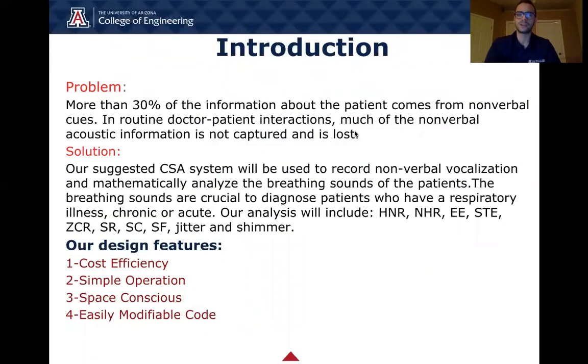When a doctor is diagnosing a patient, more than 30% of the information about the patient comes from nonverbal cues. By nonverbal cues, we mean breathing sounds. In a routine doctor-patient interaction, much of those breathing sounds are never recorded and are always lost. Our suggested CSA system will be used to record those breathing sounds and mathematically analyze them. And the breathing sounds are pretty crucial to diagnose patients who have a respiratory illness, chronic or acute.